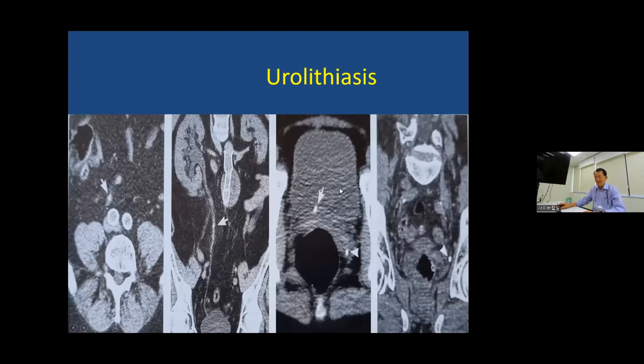Patient complaining of abdominal pain, start with the CT generally to look for stone. Radiopaque stone is common, so you can see here. Certainly radiopaque stone is easy, but radiolucent stone cannot be shown without contrast agent.